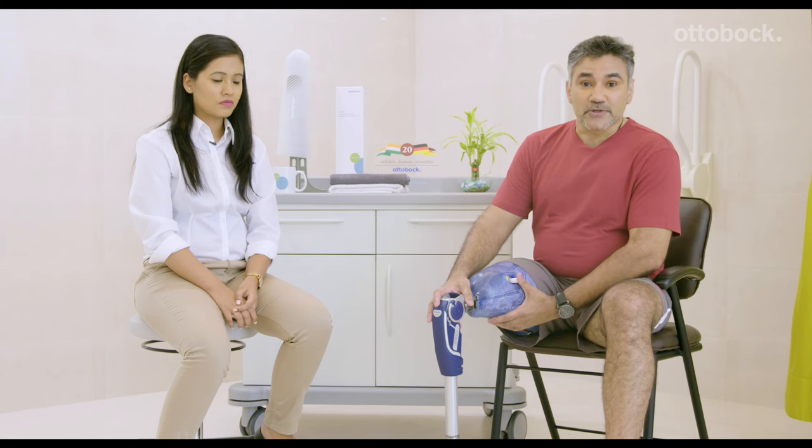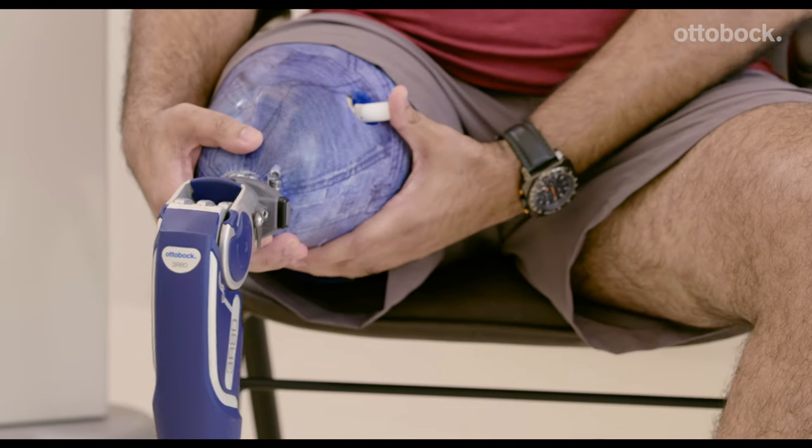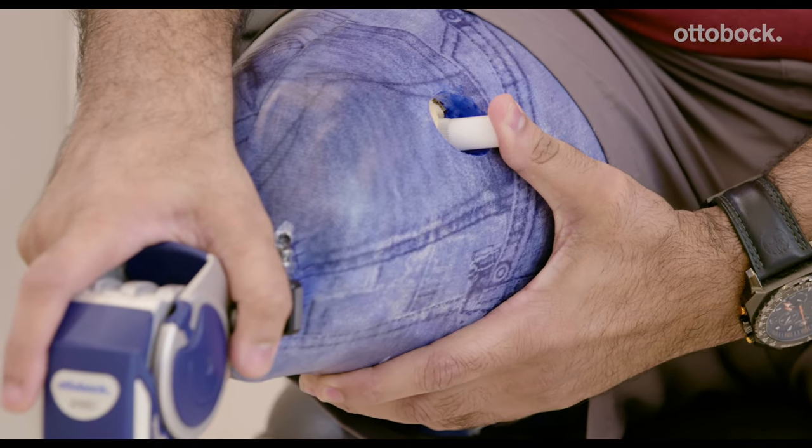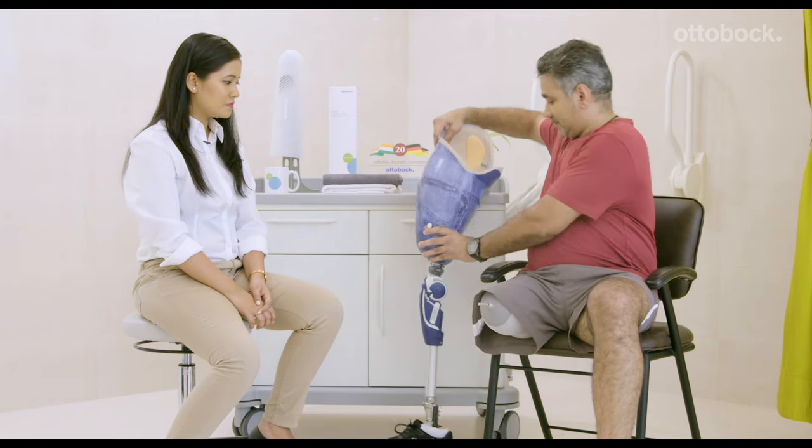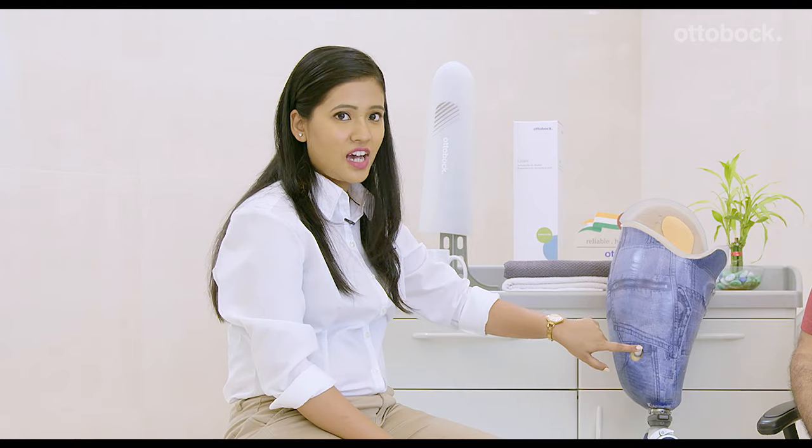To take off your prosthesis, I recommend that you sit down. Simply push this button so that you unlock the pin of the liner and then pull your residual limb out of the socket. In case your pin gets stuck and you are not able to come out of your prosthesis, press your residual limb inside the socket and then you should be able to come out while pushing the release button.